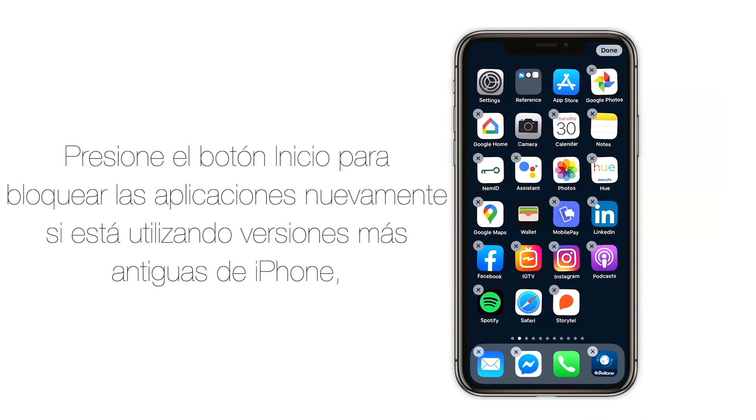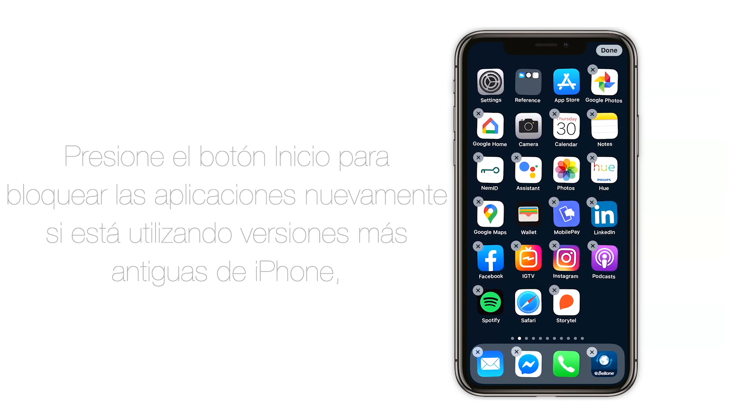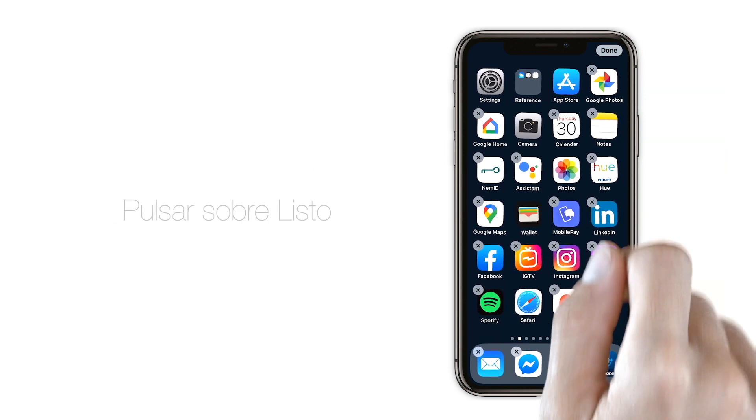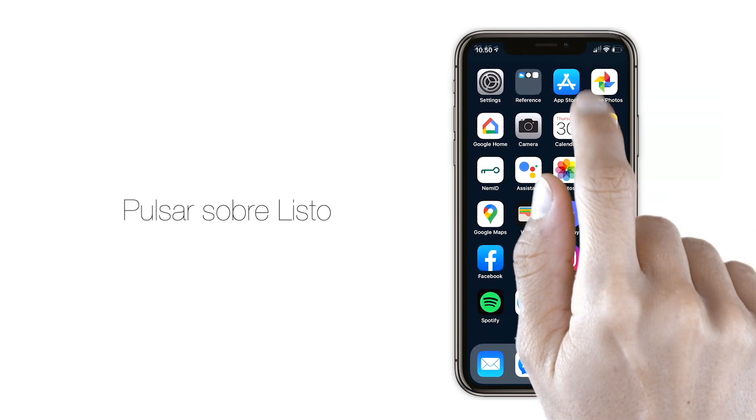Press Home button to lock your apps again if you're using an older iPhone, or simply press Done in the right top corner.